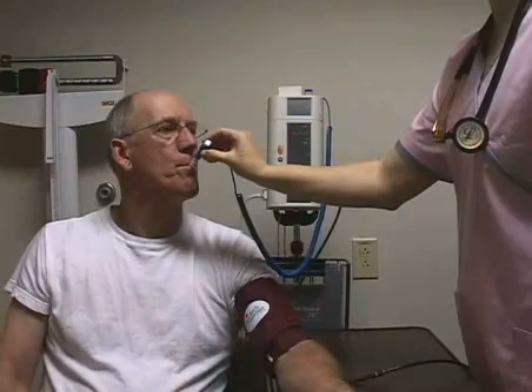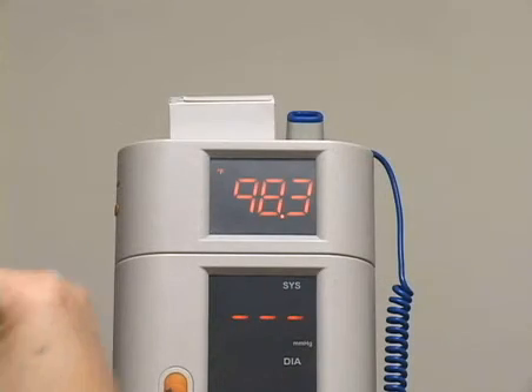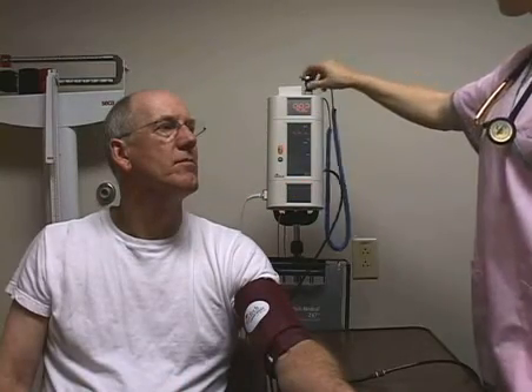Place the probe under the patient's tongue in the sublingual pocket. A traveling dash appears for 10 to 15 seconds until the reading is displayed. Discard the cover and return the probe to the module.